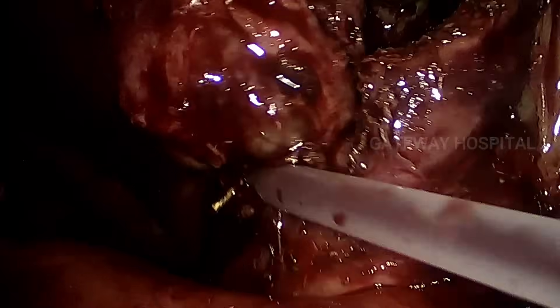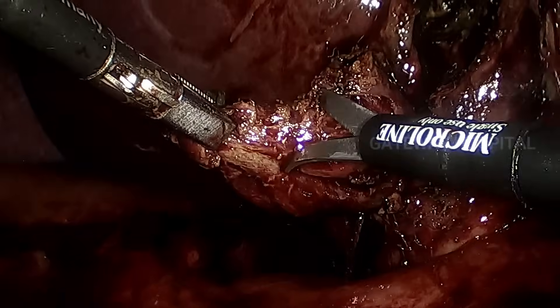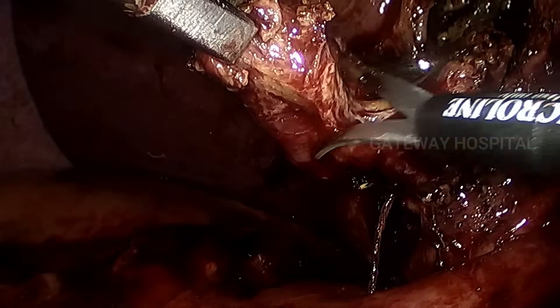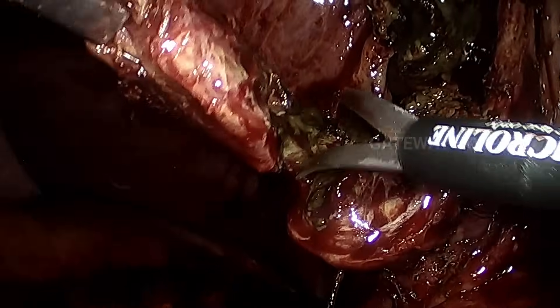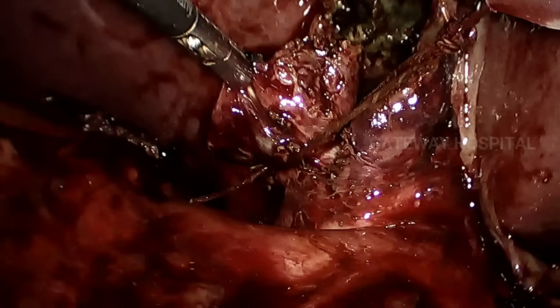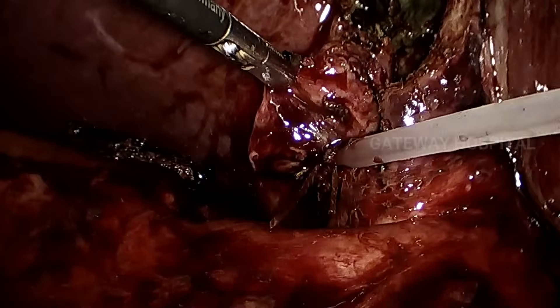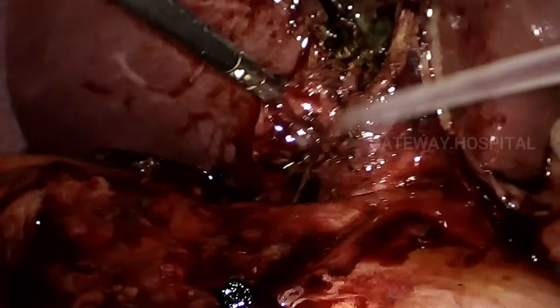We start as a subtotal cholecystectomy and gradually move close to the infundibulum-cystic duct junction, and invariably we end up completing a total cholecystectomy. We have applied one endoloop already, and this is the second endoloop, which is applied nicely. The residual infundibulum is trimmed off and all the specimens are removed carefully.